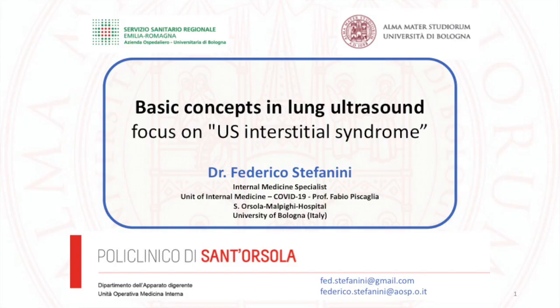I'm going to start my presentation with the basic concepts in lung ultrasound. We're going to focus particularly on what is called ultrasound interstitial syndrome.